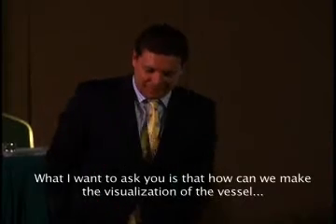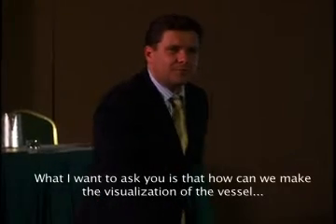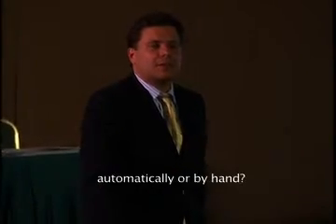Thank you very much for the presentation. What I want to ask you is how can we make the visualization of the vessel automatically or by hand? The vessels you saw were MRA, magnetic resonance angiography. As you know, the data is already pre-segmented from the scanner. All you see is the bright white signal of the MRA. So since it's a volumetric image, you load it, and the 3D reconstruction is automatic and instant.